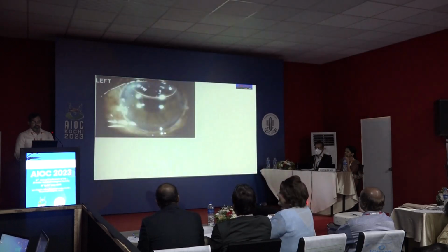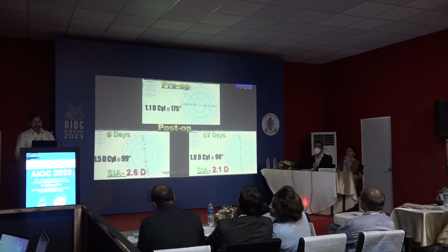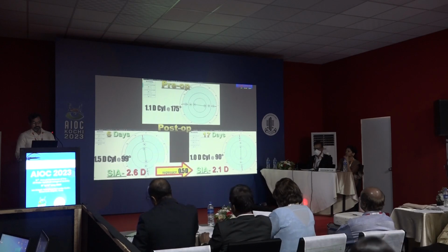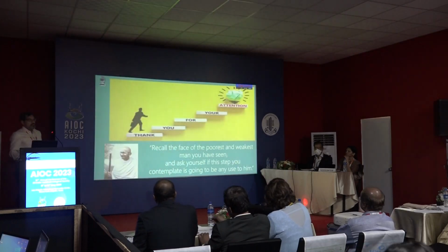These are post-op day 1 and day 6 pictures. Post-op day 6 SIA was 2.6 diopter and 2.1 diopter on day 17, which demonstrates a regression of 0.5 diopter. Thank you for your time.